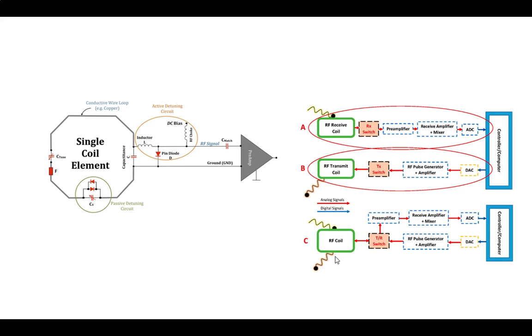These devices are really expensive and downtime is even more expensive, so you don't want downtime. It's much cheaper to replace a fuse than to have your whole system torn apart and rebuilt. So yeah, it's just the cheap versus expensive thing. But this is designed to reduce it. You have to really try. This is what you're supposed to do.